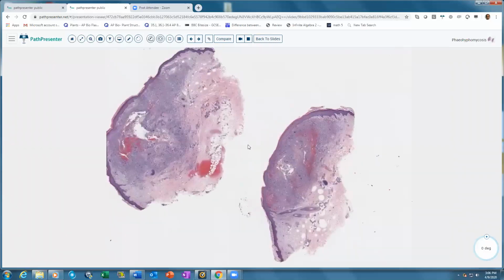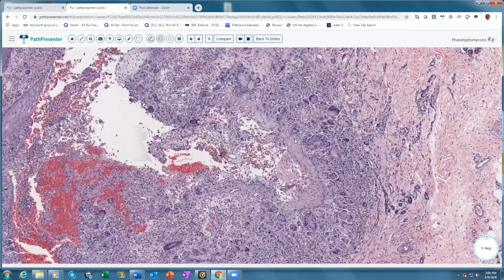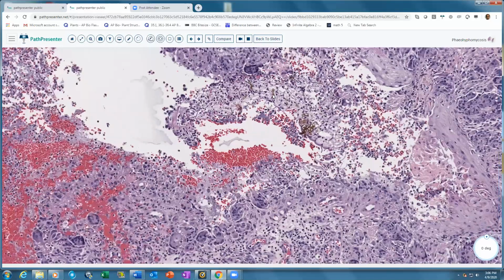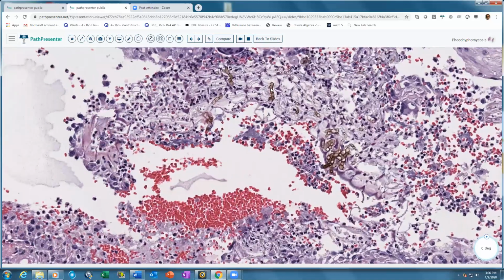So here again you can see that the background is suppurative and granulomatous, but when you go high power, you can easily see these pigmented fungi, some of them forming hyphae. There you can see the hyphae, and some of them are round spores. So you can see the copper penny-like structures, but also the hyphae, and when you see both of them, this is Phaeohyphomycosis.